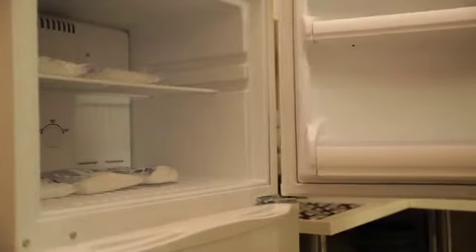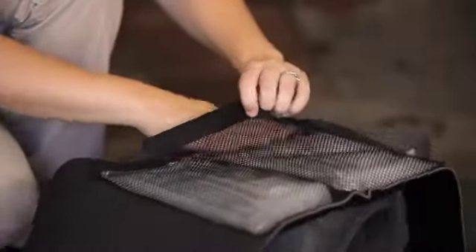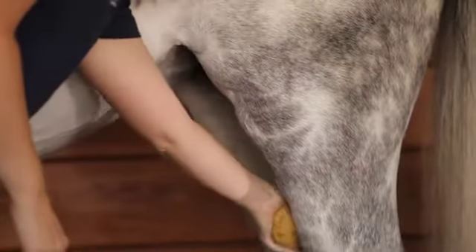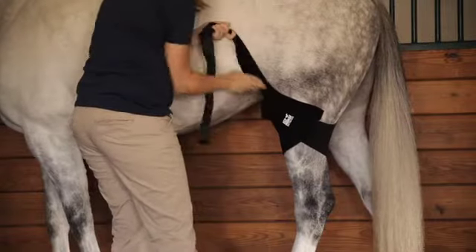To apply, begin massaging your frozen First Ice pack for about 10 seconds. Then place your packs in the inner sleeves of the wrap. Using cool water, sponge the area to be treated. Then separate the right and left wrap. Working one side at a time, place the ice wrap against the stifle area.